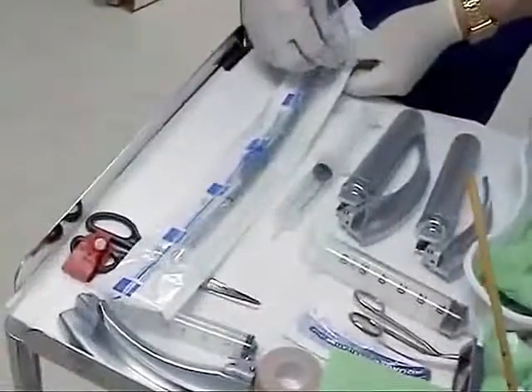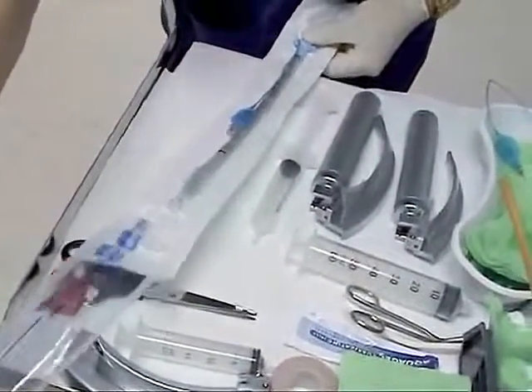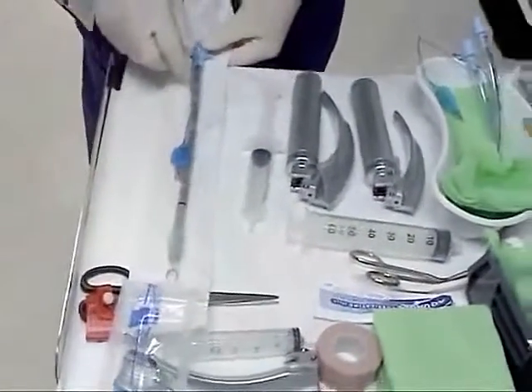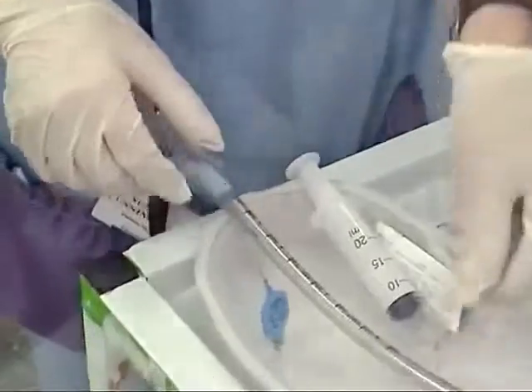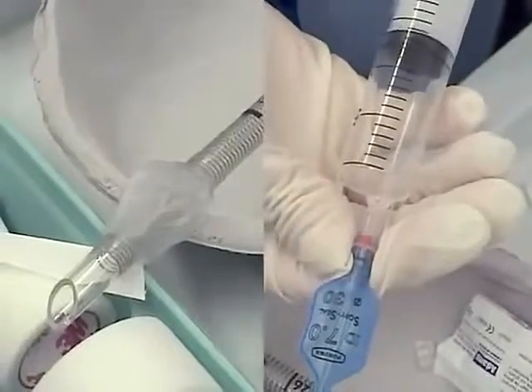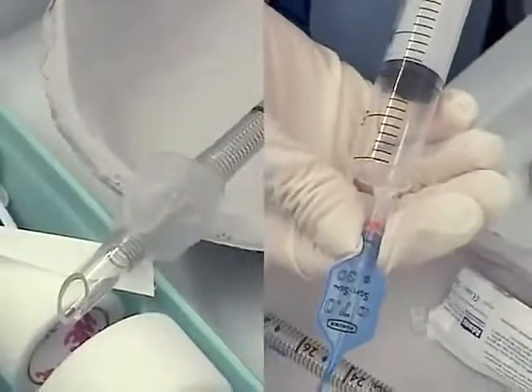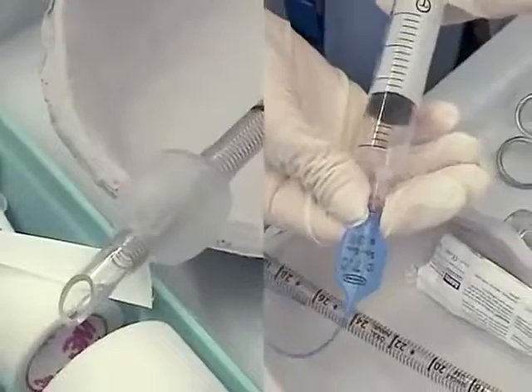When the size of the reinforced tracheal tube has been determined, it should be removed from the sterile packaging. The tube and cuff should be examined for signs of damage and ensure the lumen is free from blockage. The integrity of the cuff, inflation system, and stylet should be checked prior to intubation.